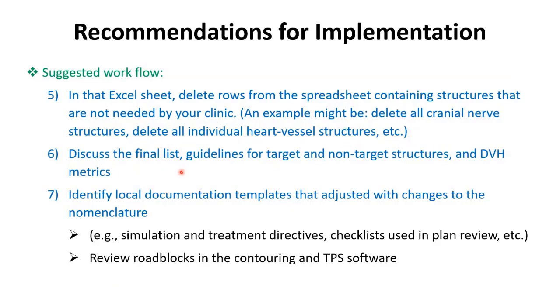Discuss the final list among your department. Guidelines for target and non-target structures and DVH metrics. Identify local documentation template.